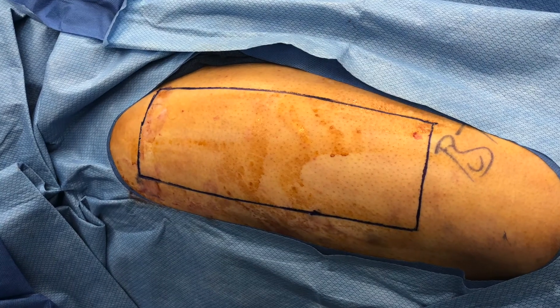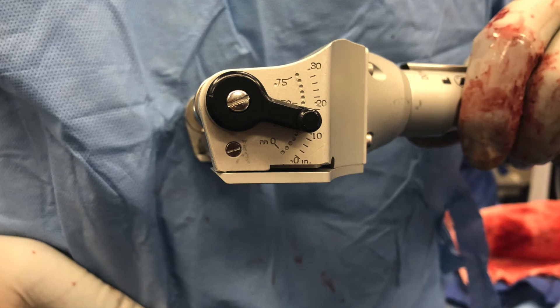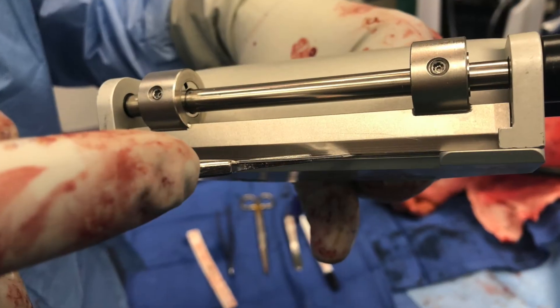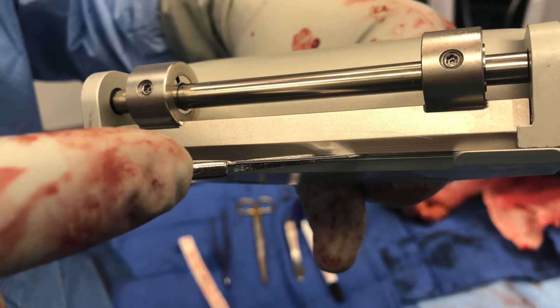Here are my final measurements drawn on the patient's ipsilateral thigh for harvest. The thickness is set on the dermatome, and we can check this with a 15 blade that fits just perfectly through the slot.